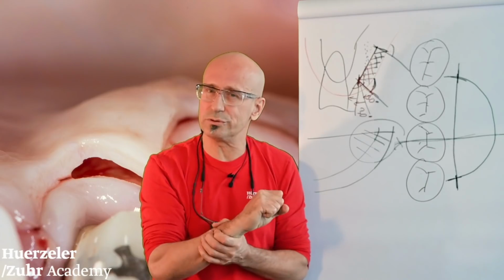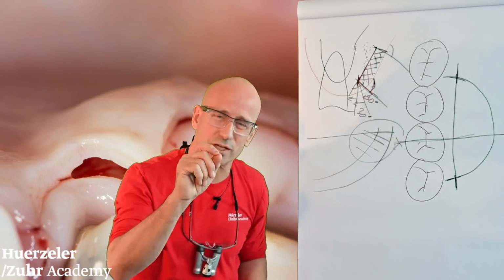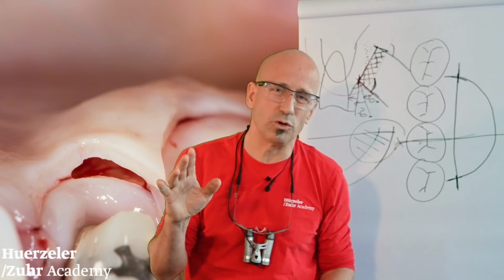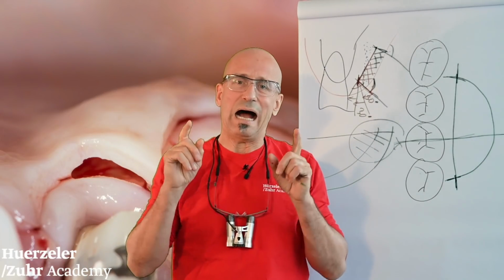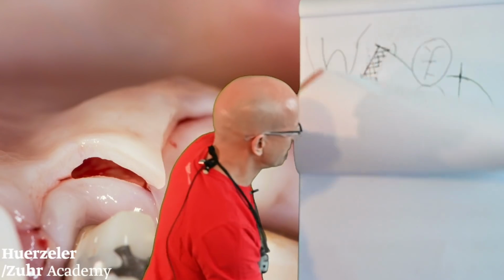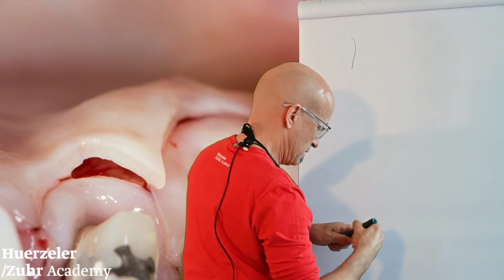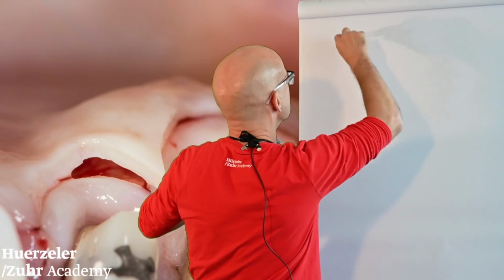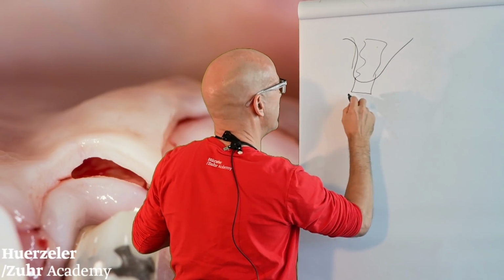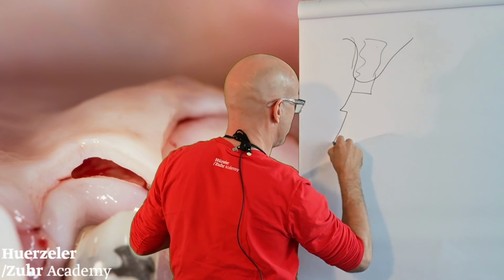We have to go to implant dentistry. I ask you a question, which many of you pretty sure can answer. How thick? Let me draw this briefly. When we have an implant here in the bone, and now we create here an individualized abutment.